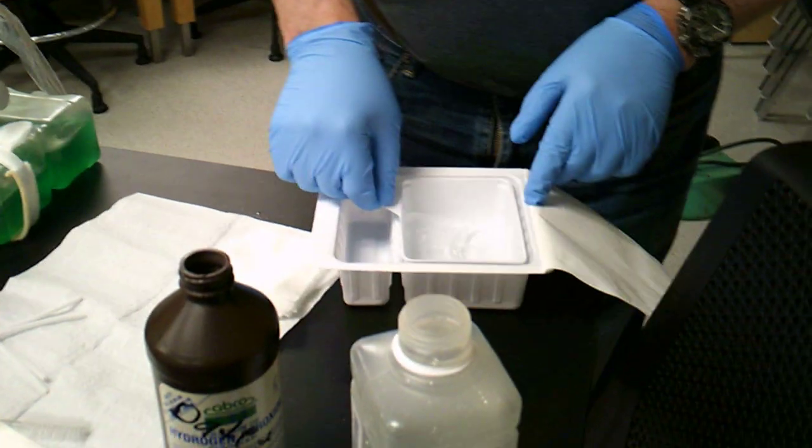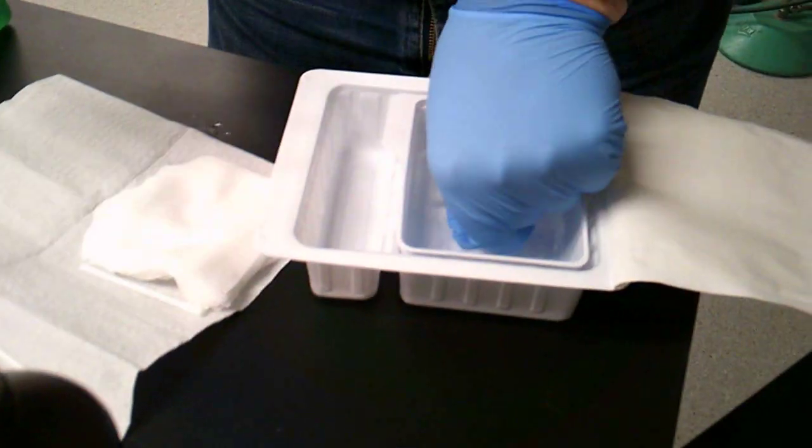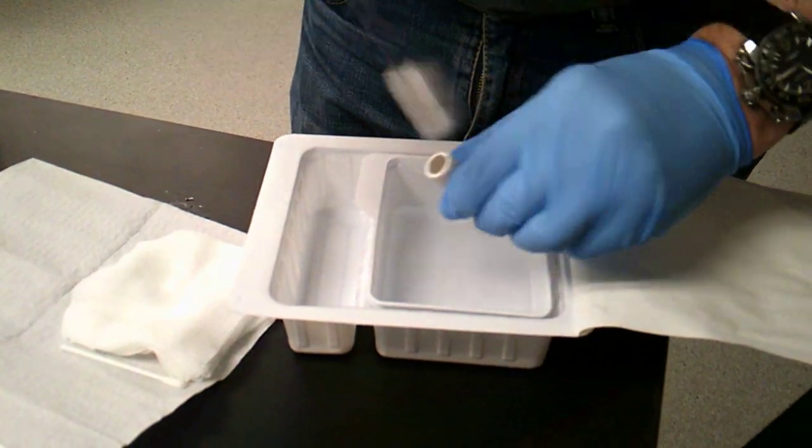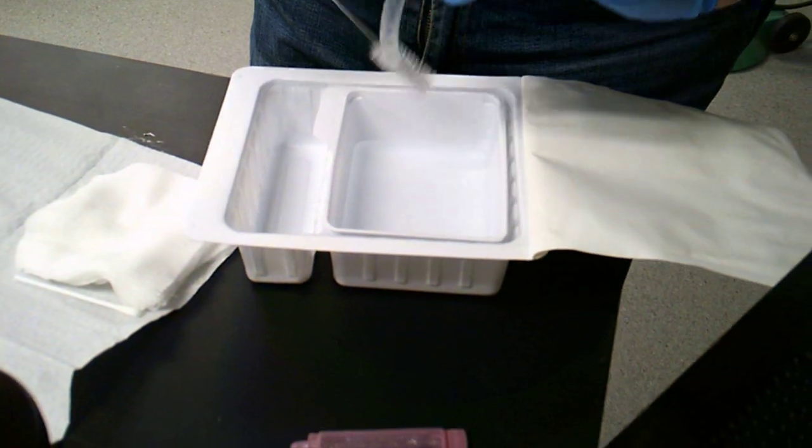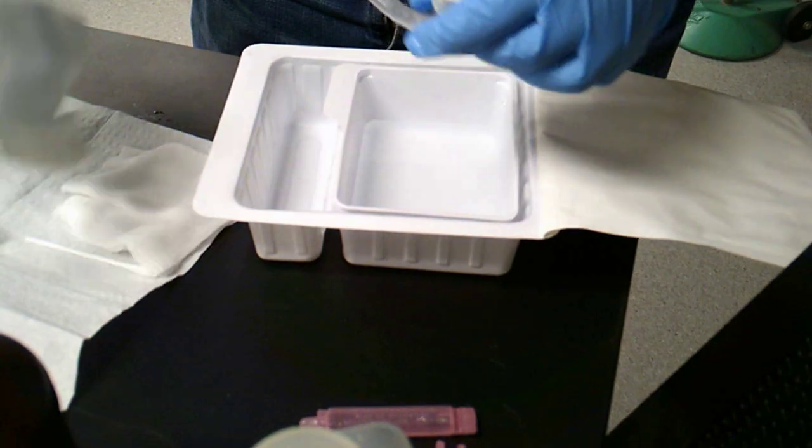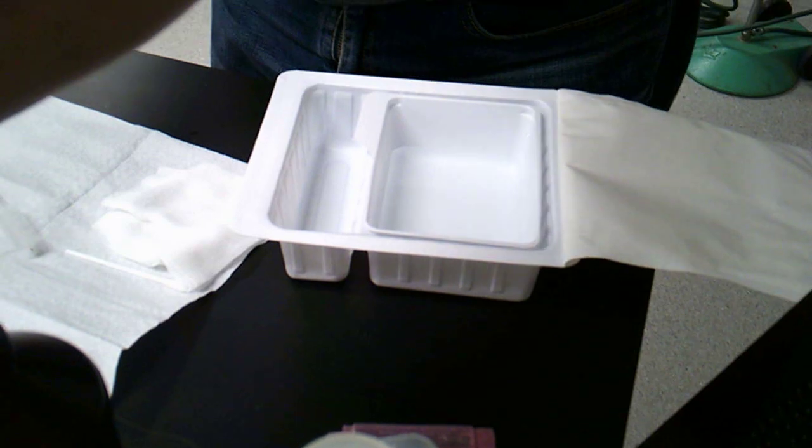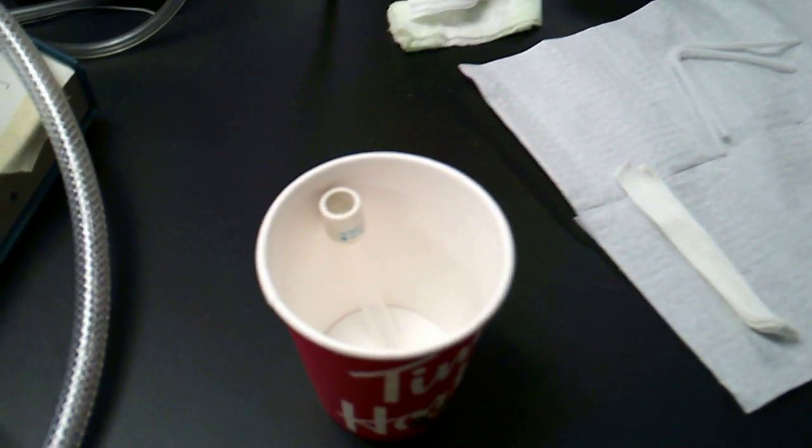We then come over to our inner cannula. We're going to go ahead and clean it. Dry it. And allow it to use for the next time. So, we'll swap between the two.